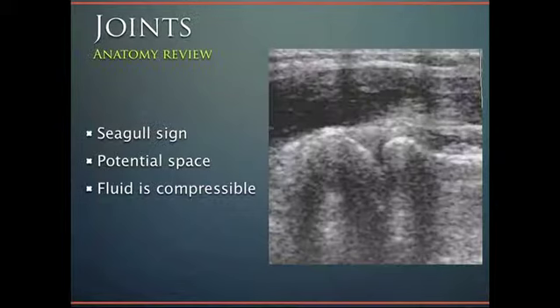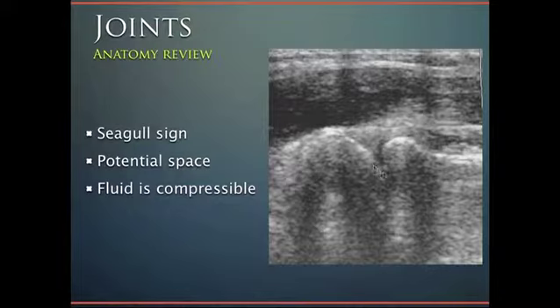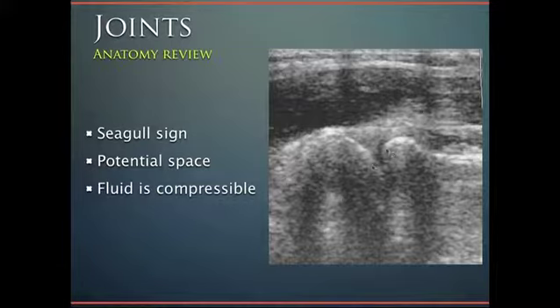When we get to the joints, because one bone comes up to another bone, you can see these bony ends — this is what we call the seagull sign, as it looks like the wings of a seagull at the joint spaces. This area is where one bone comes in contact with another, forming the articular surface. In between the two articular surfaces is the joint space. In this case the patient does not have any fluid in the joint space.